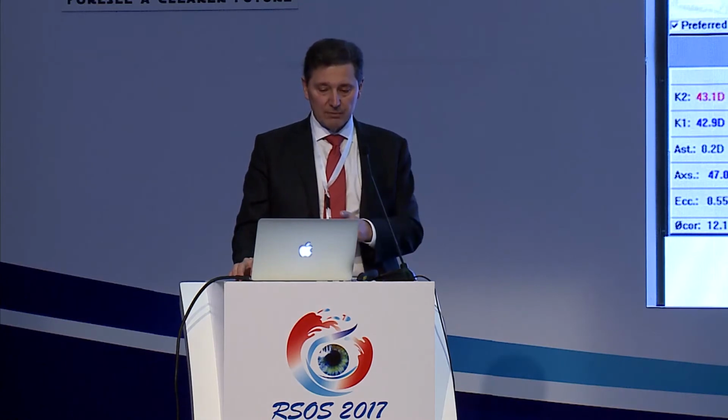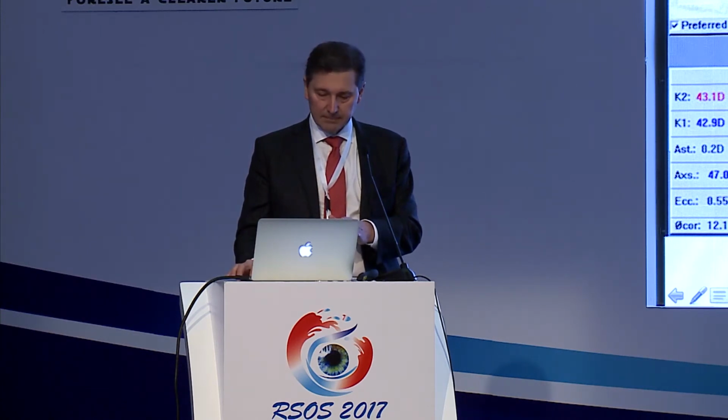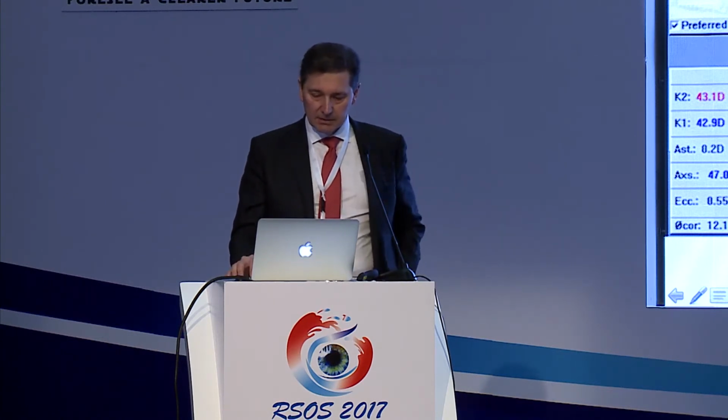Whatever we see, the pattern over there has a refractive component, sphere and cylinder. The basics of sphere is that 15 microns are needed to correct one diopter. So we're going to make an adjustment now based on our higher order ablation profile. There's our preoperative topography. This is the ablation profile that's come up with a 0 correction. It's got a hyperopic profile. The steepest point on the periphery is at 8 microns.